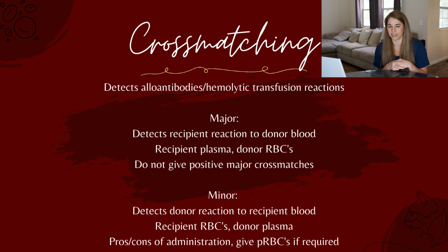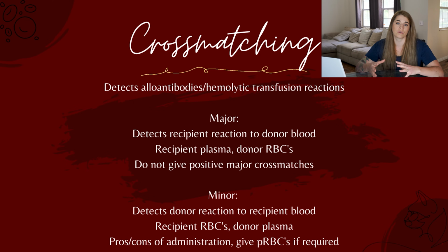Major cross-matching tests for a transfusion reaction of the recipient's blood against the donor's blood. So to perform a major cross-match, you will need recipient plasma and donor red blood cells. If there is a major transfusion reaction, you should not administer the unit or the donor that you're testing against.